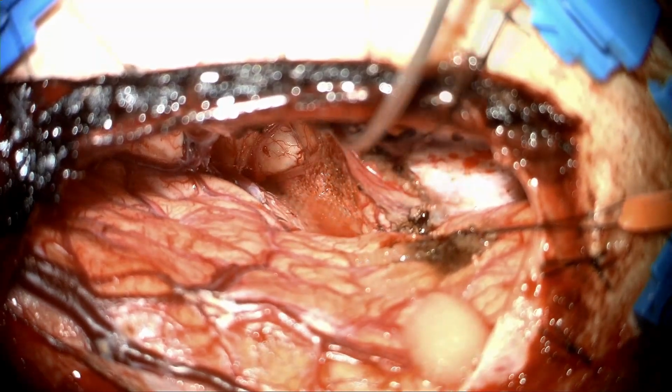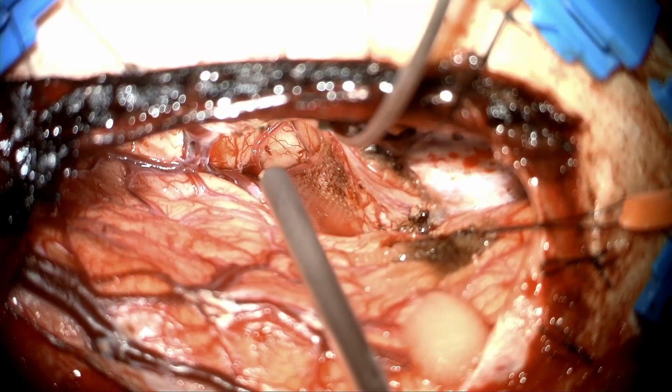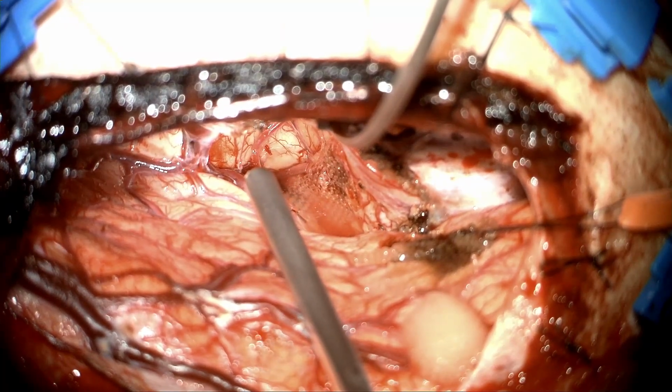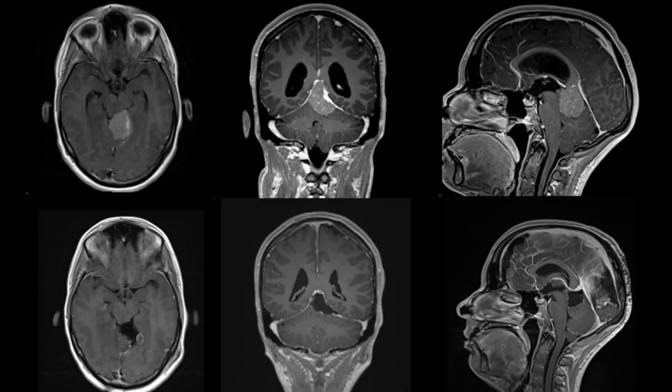We resected the implantation base of the tumor, therefore a Simpson grade 1 was achieved. Pre-op symptoms improved, and the patient was discharged without further deficits.